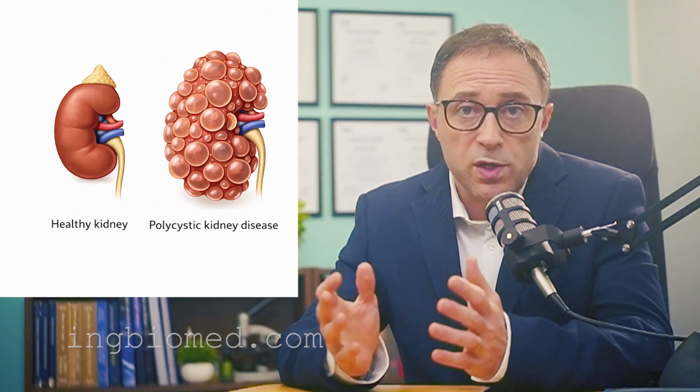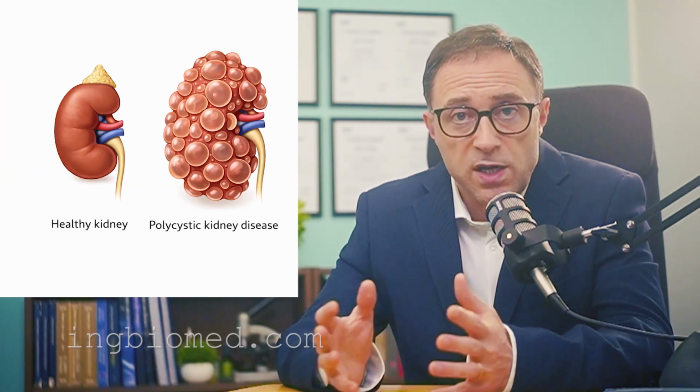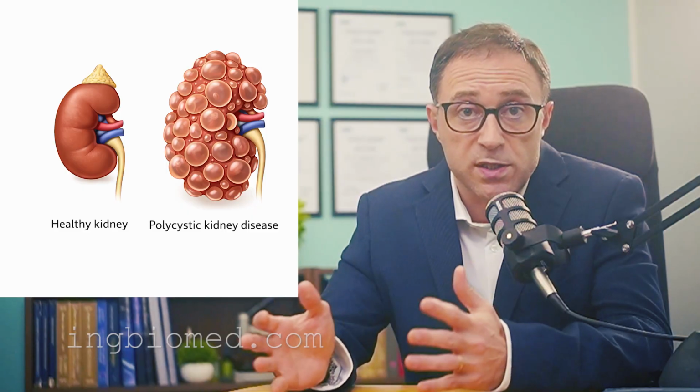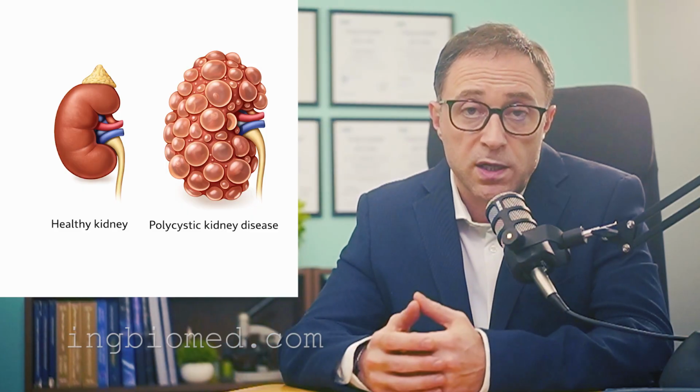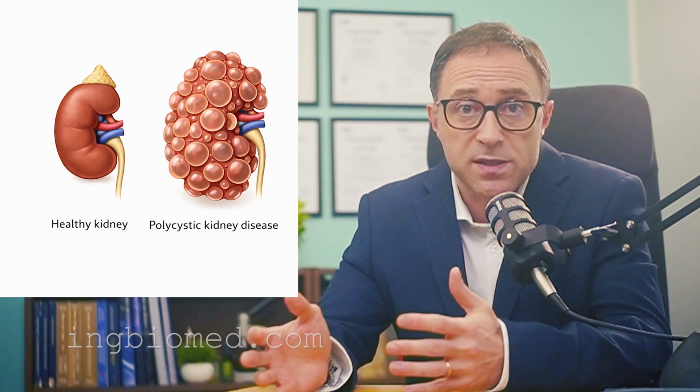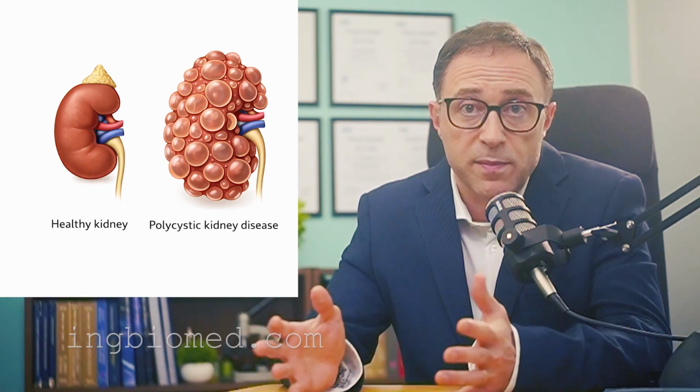It is also essential to differentiate simple cysts from autosomal dominant polycystic kidney disease, in which multiple cysts progressively compress and thin the renal parenchyma, potentially leading to renal failure.